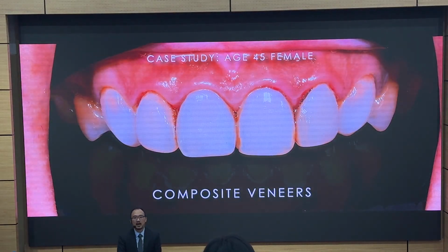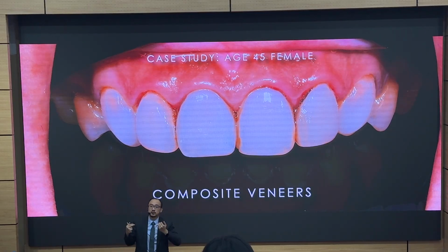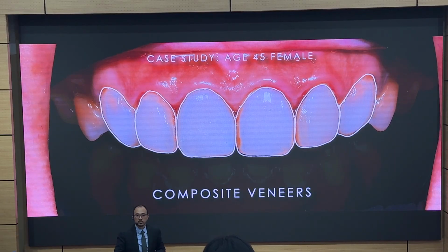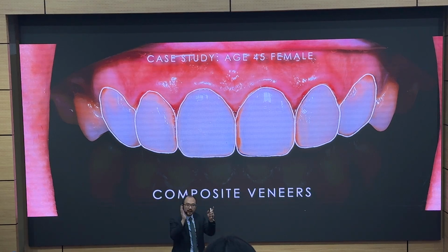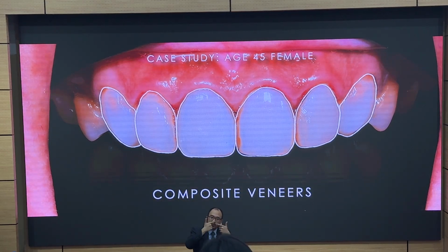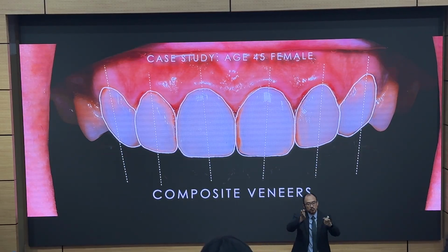This is before. This is what she looks like afterwards. And this is around 20 minutes of work, following the step-by-step that I showed you a while ago. Let's go through this again. The incisal edges, they're more symmetrical. The embrasures, this part, looks a lot nicer. And because we played with the embrasure, we removed all the excess around the gingiva as well, I'm able to play with the axial inclination. Therefore, if you look at the case, it looks more symmetrical.